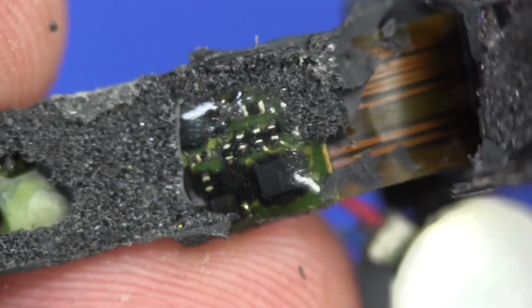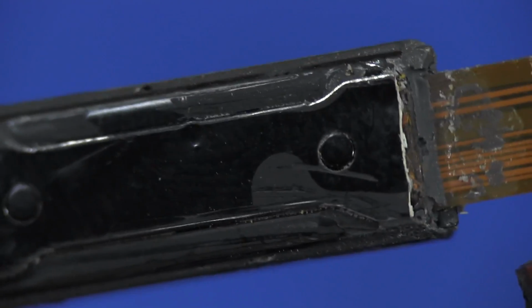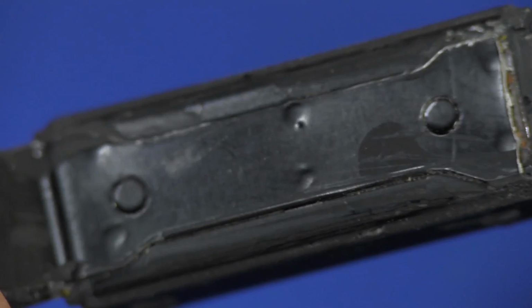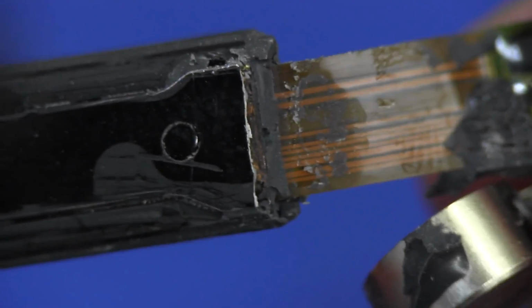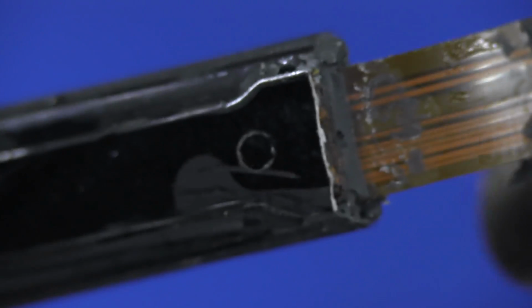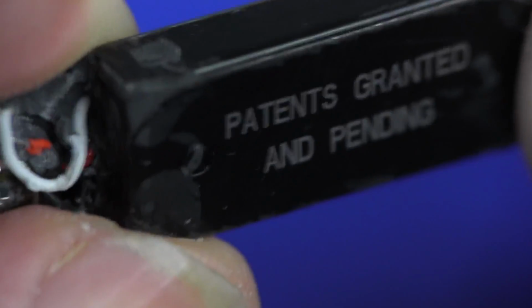We've got double-sided load. Now this is, as I presume, the battery module, but it seems really thoroughly attached to this metal spring back band on it. Now I was able to snap off, you can see I've snapped off this side of the metal band here, but I really can't get that apart. I mean, I prized off the rest of all the boards and all the flex stuff. I pulled those off, no problems at all. So if you can see that, all the others separate from the steel back band on that, but this battery in here just doesn't want to come out, the bastard.